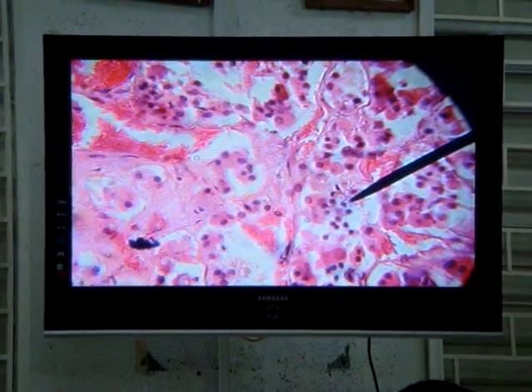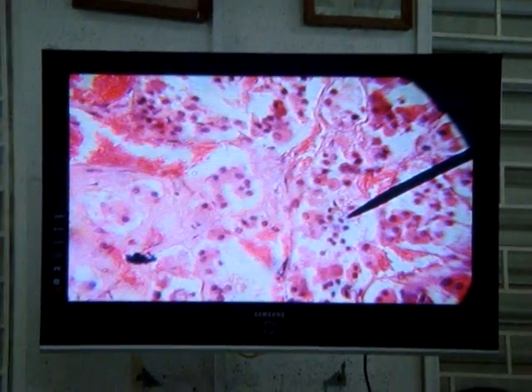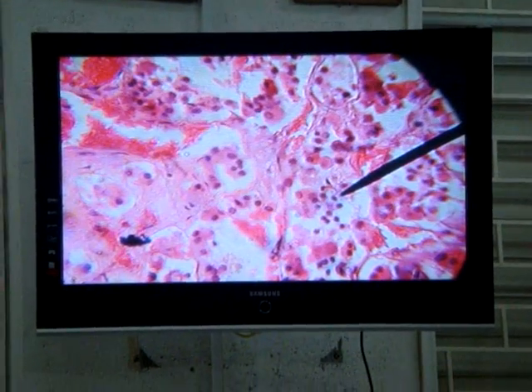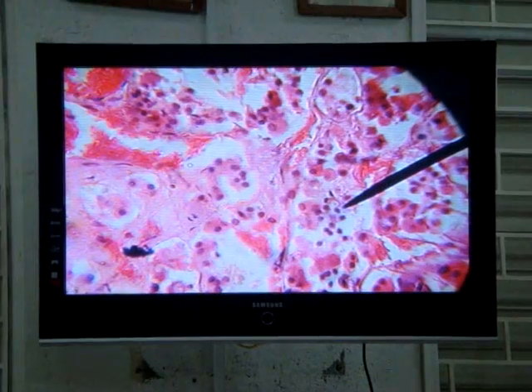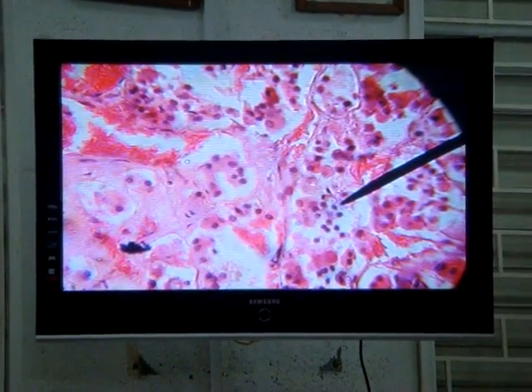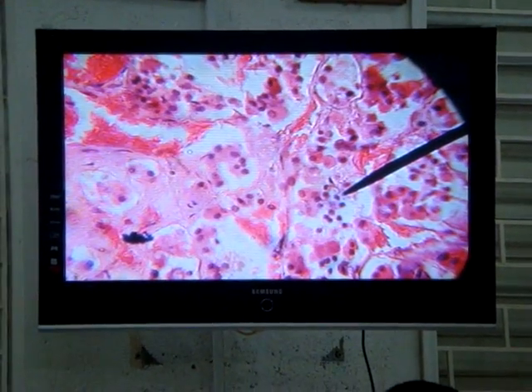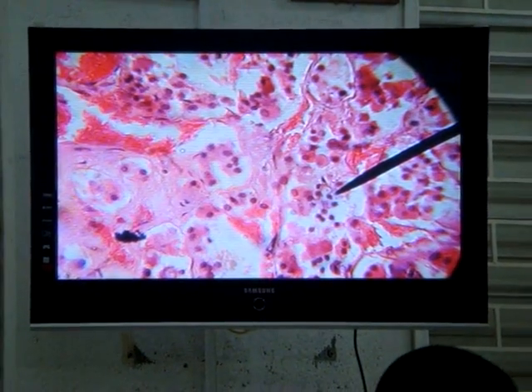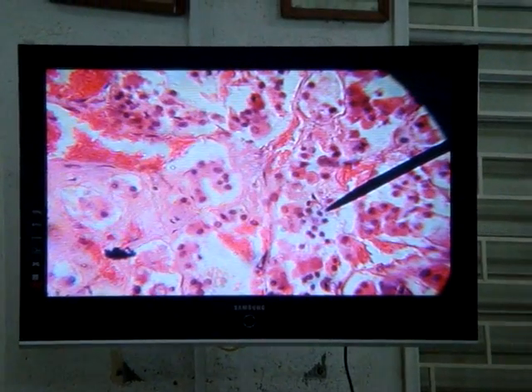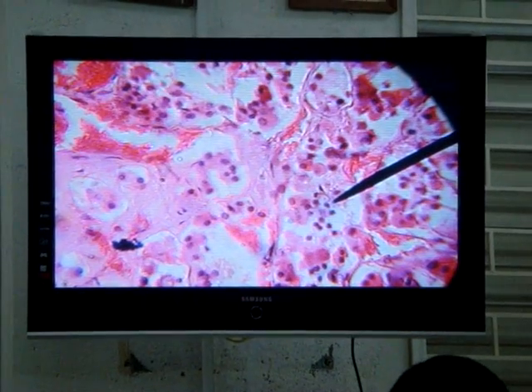Now the chromophobes are reputed to be stem cells. These chromophobes are stem cells, precursor cells. They give rise to other chromophils. Although these chromophobes appear to have no cytoplasm, that is obviously not true. They just have scanty cytoplasm. The cytoplasm is not as abundant as the others. So these chromophobes are giving rise to the chromophils.